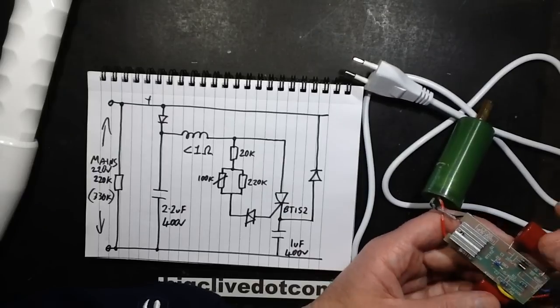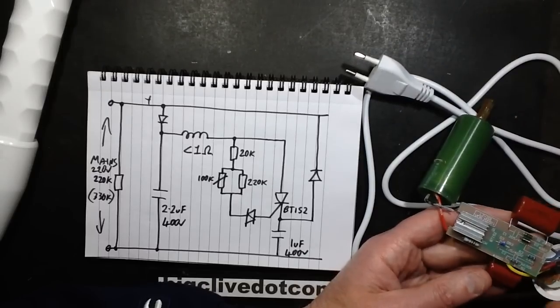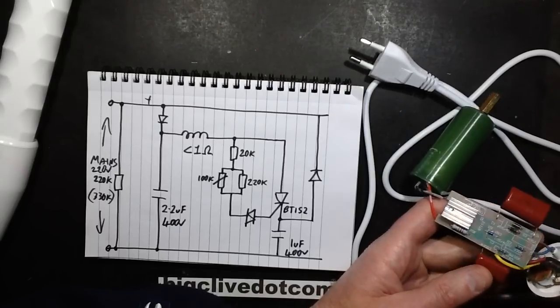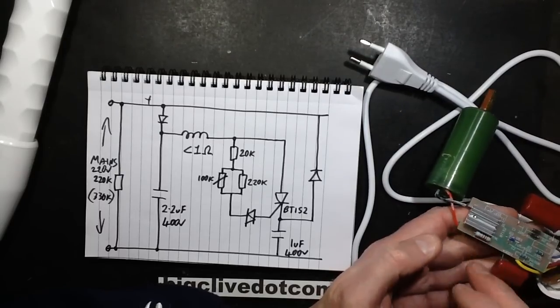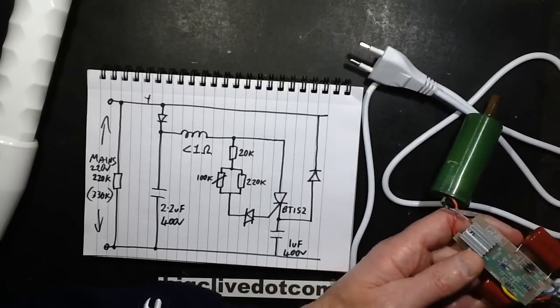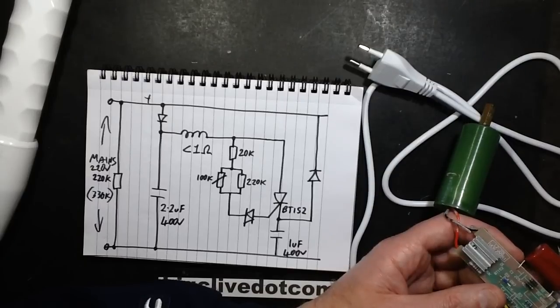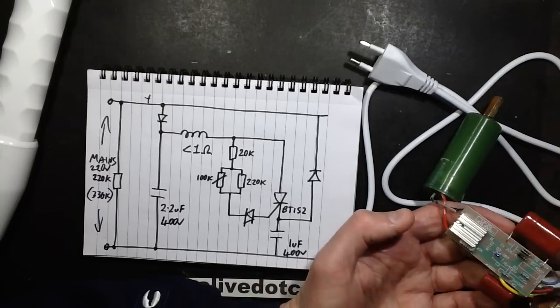There are two diodes, two big capacitors. There's this resistor here in parallel with the potentiometer, and the switch on this input here. There's one unusually large resistor, I have to say, a thyristor, a BT152 thyristor, which is like half a triac. It switches on a half wave only. And the circuitry, that's really about it.